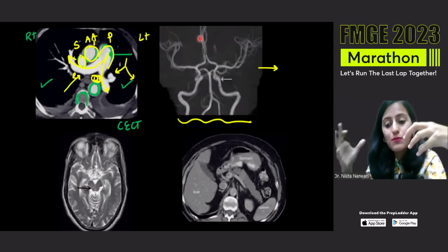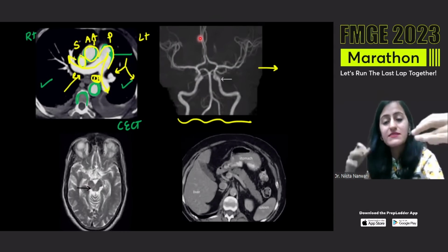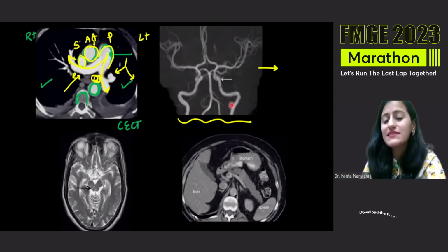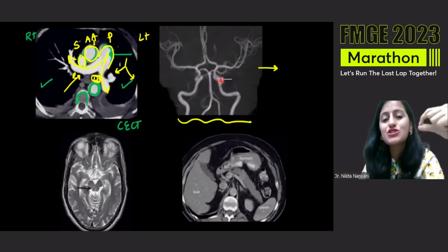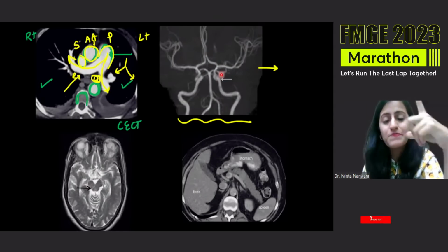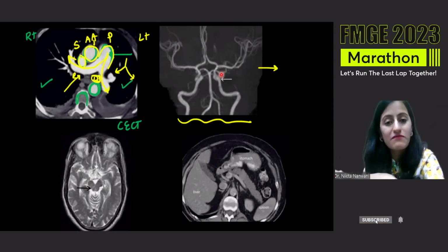Are we seeing only one side's vessels, Kirti? Are we seeing only the right side or the left side? Thank you so much, Devtaru. We are seeing both sides' vessels. DSA, digital subtraction angiography, is done by putting the catheter into the artery. It's one side at a time, one vessel at a time, and its branches. We are seeing both sides.